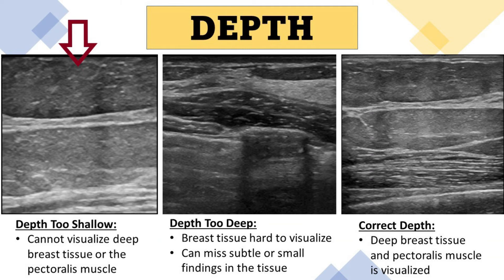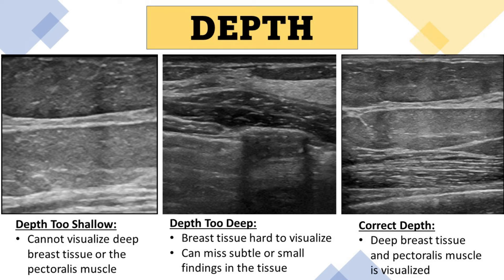In the first image, the depth is too shallow — you cannot visualize the deep breast tissue or the pectoralis muscle. In the next image, the depth is too deep; the breast tissue is hard to visualize because it's so far away and small, making it easy to miss subtle or small findings. In the last image, the depth is set correctly — you can visualize both the deep breast tissue and the pectoralis muscle.